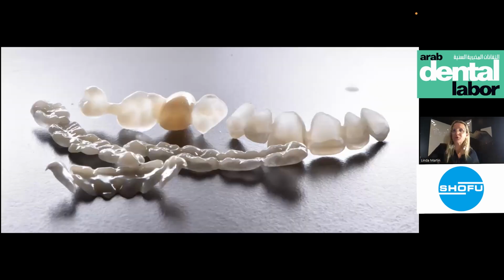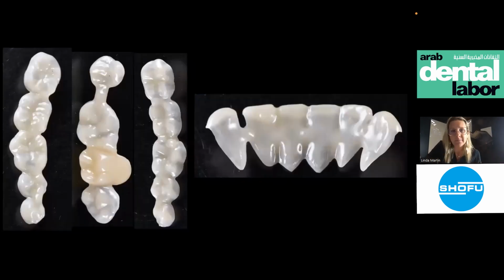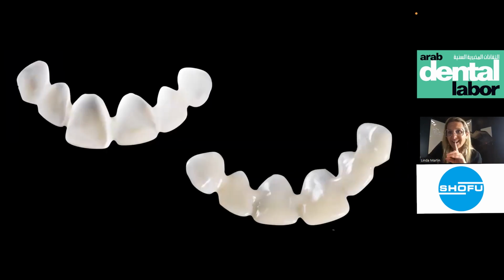So my prosthetist, the laboratory, made that. It's temporary, not a key, but a temporary crown. It's not a crown. It's just a small piece of composite that I will put in the mouth, but with a new occlusion, to be sure that Olivier is okay with that. So you have the upper and the lower edge. This is from the anterior teeth, because before we prepare the veneers, we prefer to use this kind of composite to rehab the occlusion, okay?